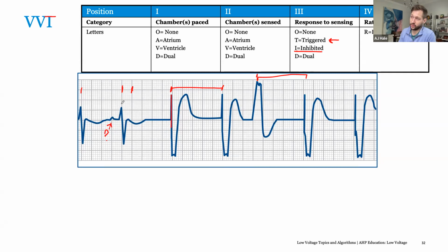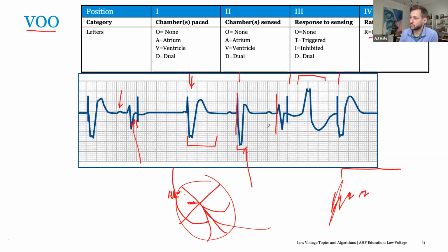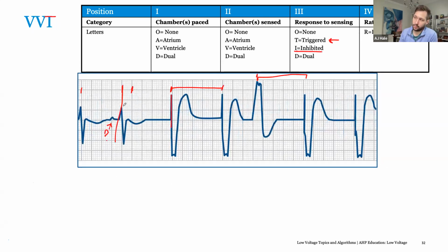So if this occurs right here, it will go ahead, as soon as it senses, it will also give a pacing spike. Oops, a little off center here. But you may end up with something that kind of looks like a fusion right here, where we will be pacing into this intrinsic complex, not obviously in the vulnerable period here, because this is a big no-no.